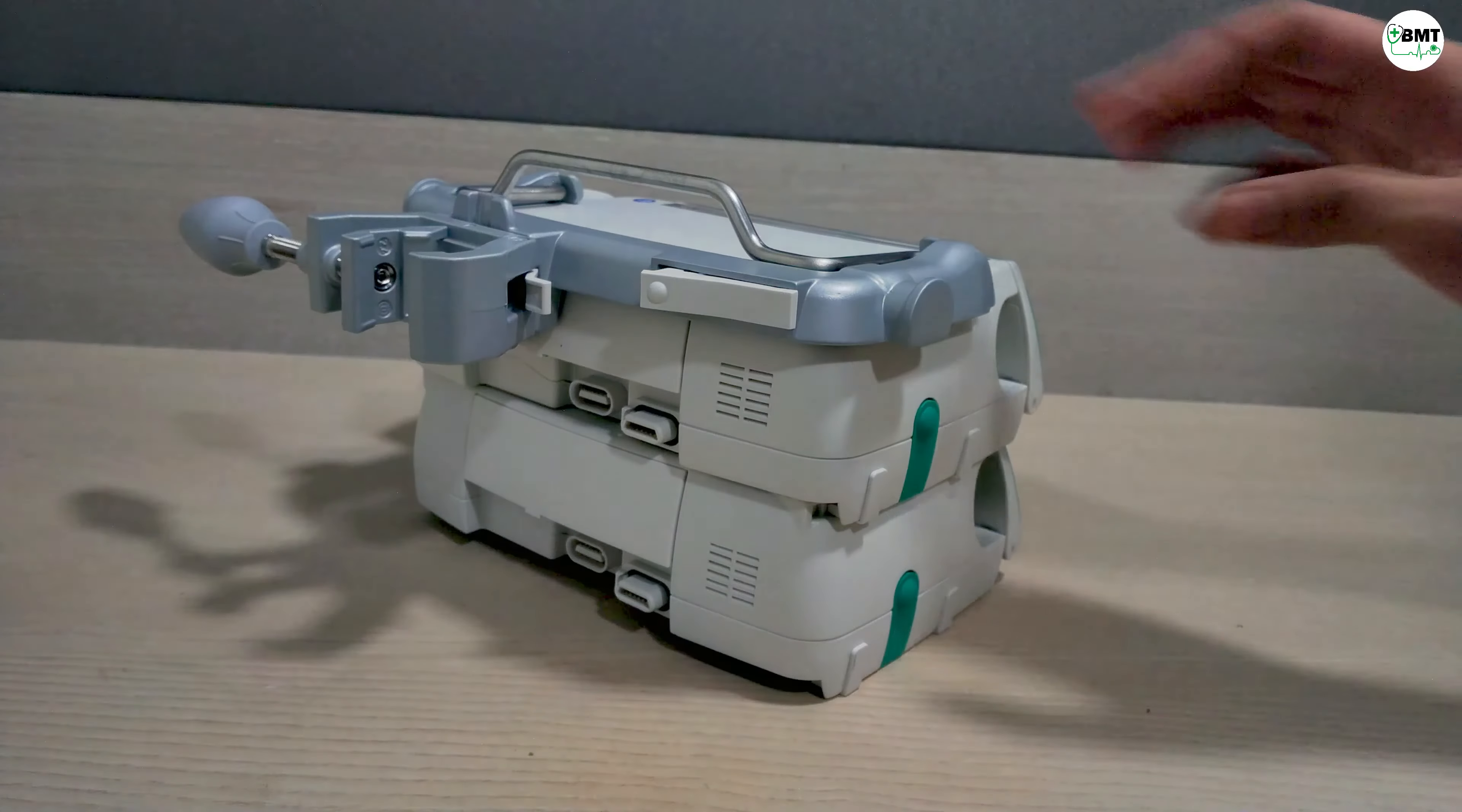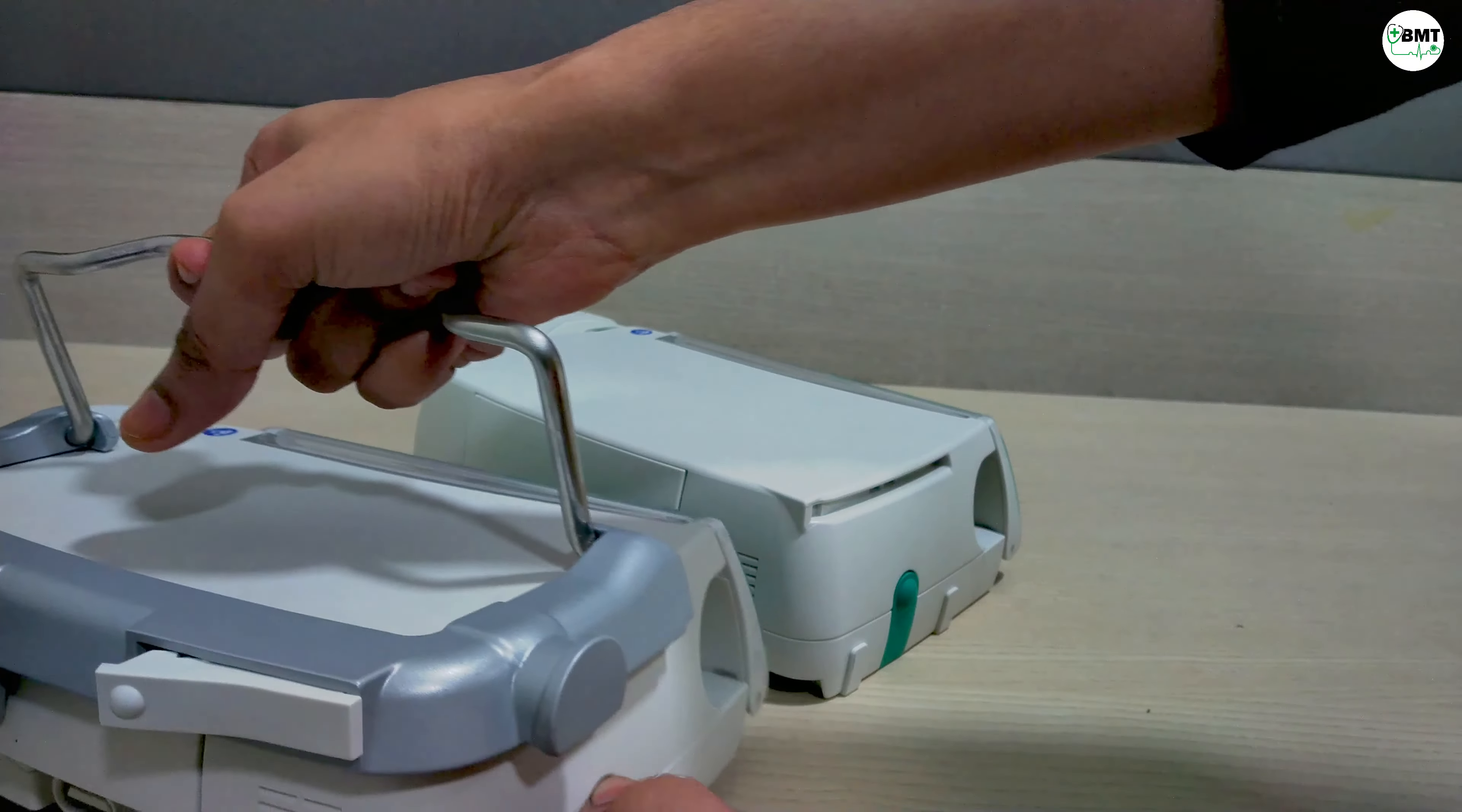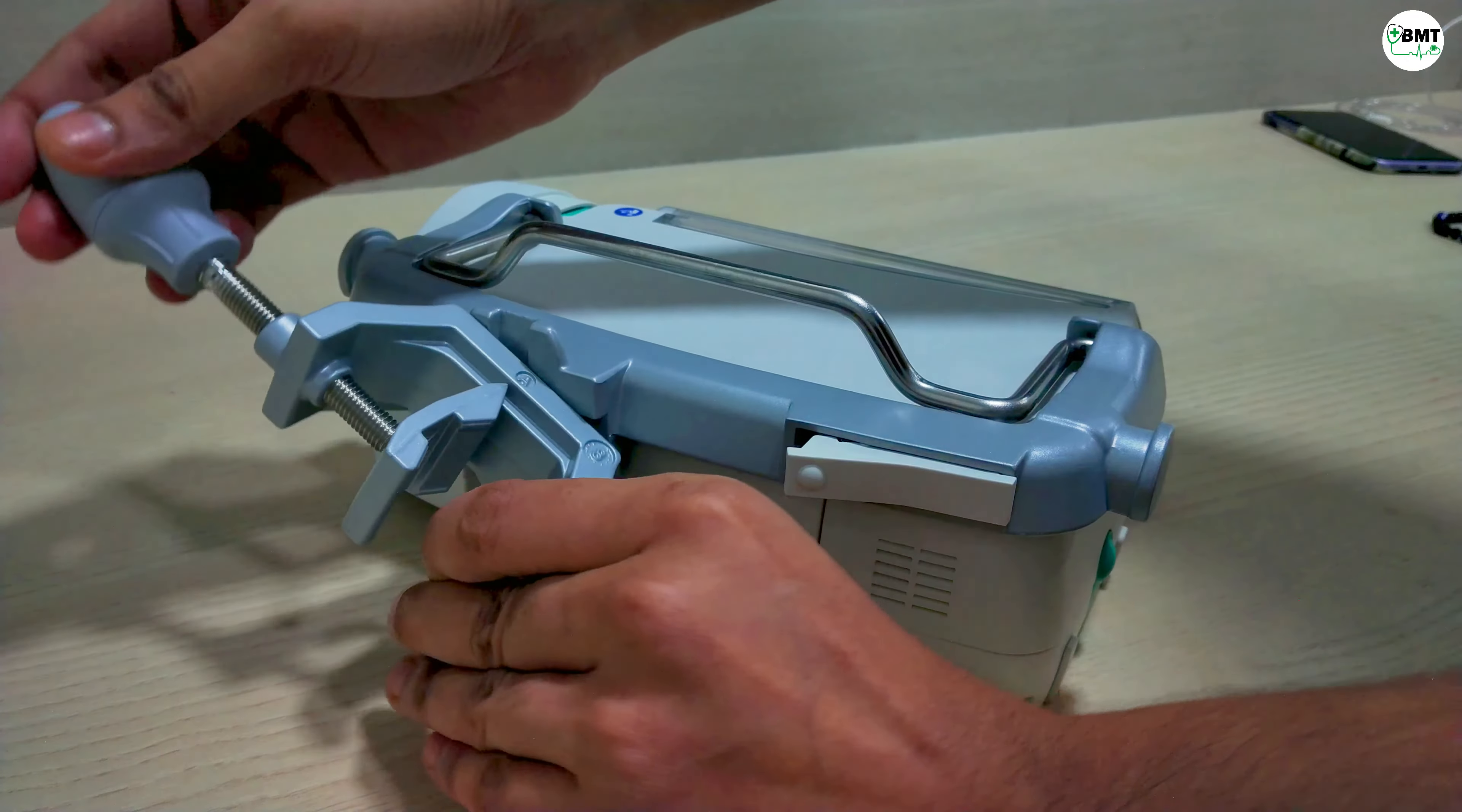For disconnecting this, this green button, press and disconnect. For rotating this clamp, here one knob is there. Press and disconnect.